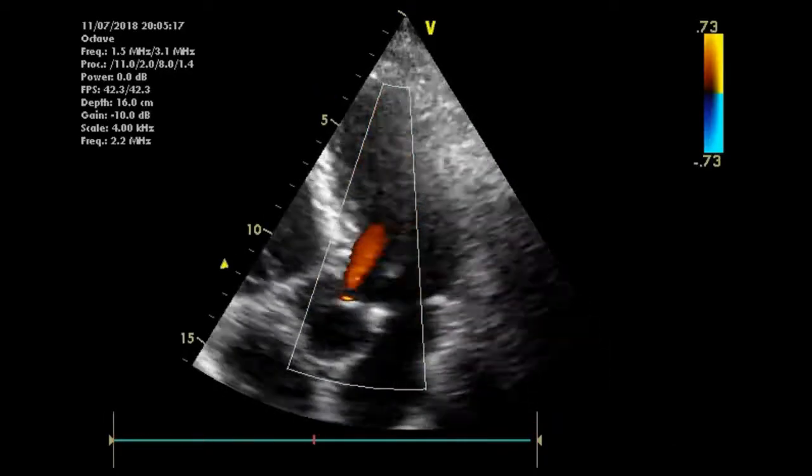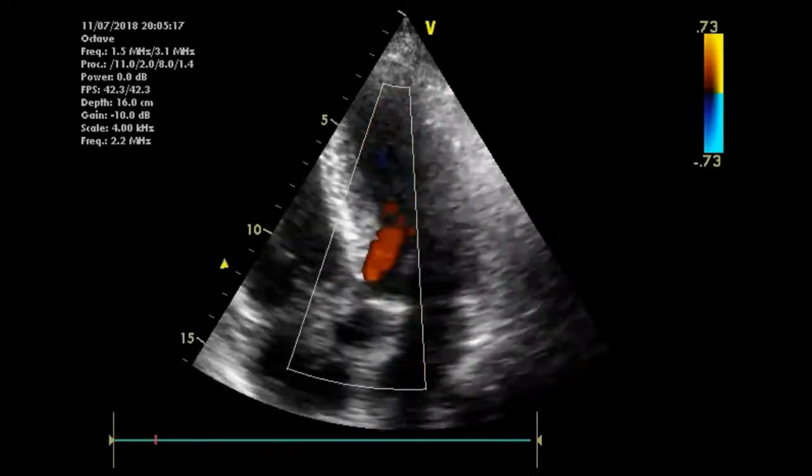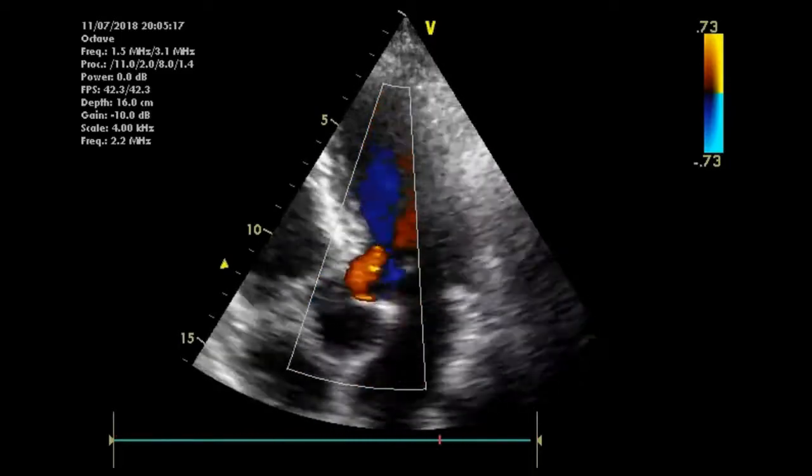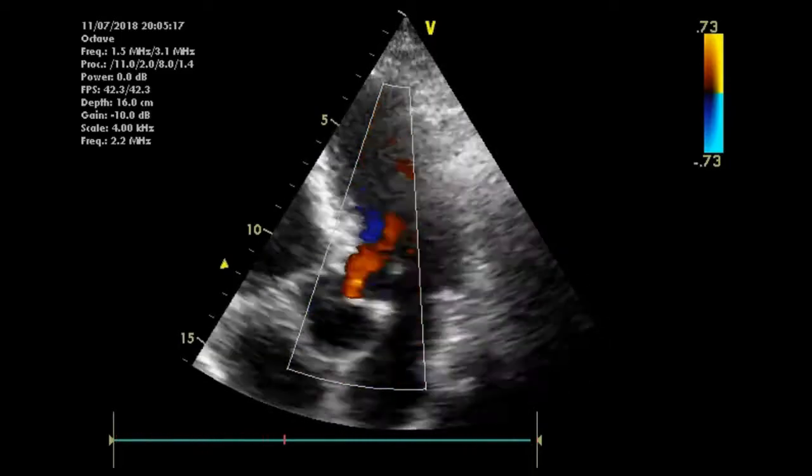This is an example of a patient with aortic dissection, in which the dissection caused acute aortic regurgitation. It's mild in this case, though.